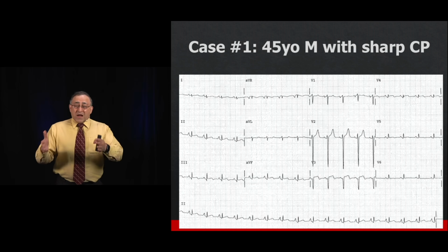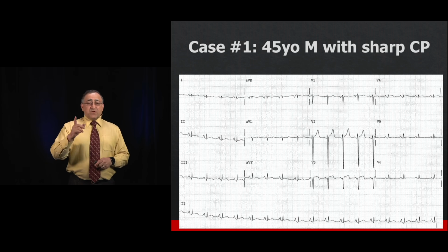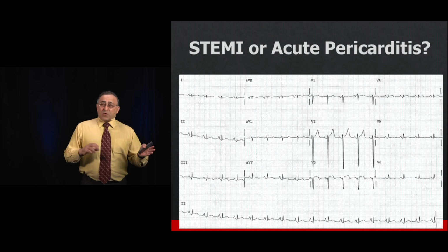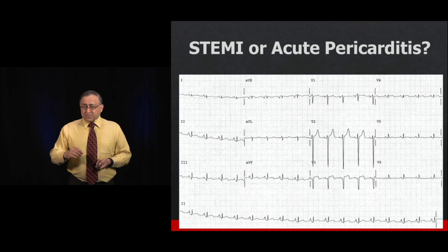So what went wrong? I thought PR depression equals pericarditis. First pearl, that is a myth. It doesn't work. So let's talk a little bit about what you need to do when you're debating, is this STEMI or is this acute pericarditis? I'm going to tell you the way to approach these cases.